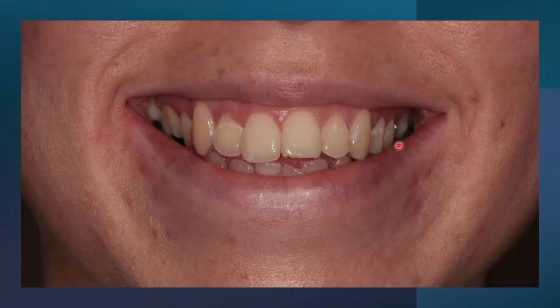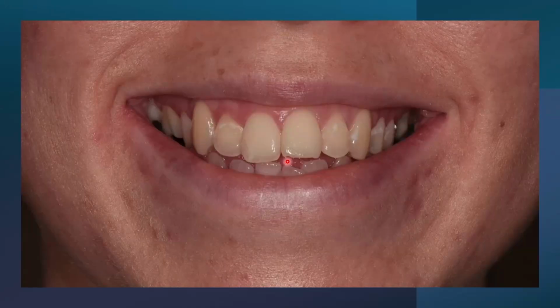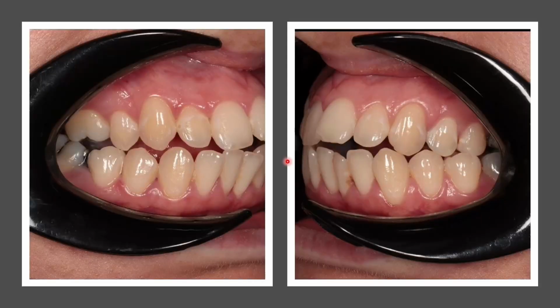The presenting complaint was the maligned lower incisors and the tipped upper left one, which gave it a slightly crooked appearance. And I think it was quite damaging to the smile, actually. I can understand why somebody would want this fixing. But we have a lot of occlusal issues at the back. And in aligner work, we would sort of call that a cuspy occlusion. It doesn't look particularly stable, and so it's important in a case like this.